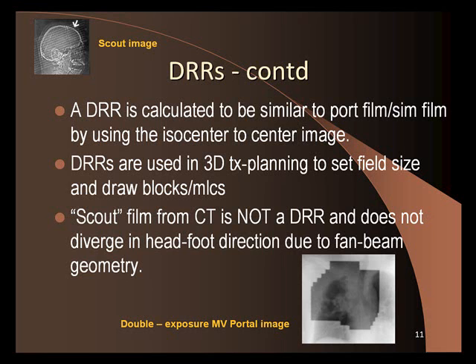Okay, so why are we acquiring DRRs and sim films? I keep saying we're going to take this film or we're acquiring. Do you know why we're taking these? Why these DRRs and sim films are important? I did mention one thing: you put the isocenter on, you draw the blocks. What are we going to do with these? Did Theo and Joe talk about the purpose of sim films and DRR films? Who's going to look at them? Yeah, oncologists and physicists are going to look at them.